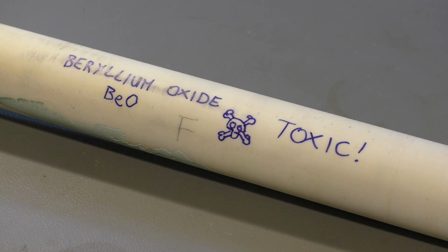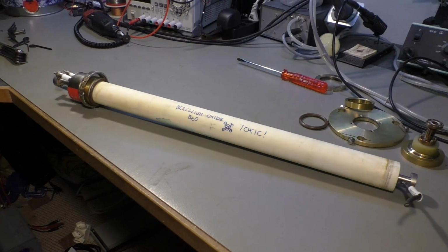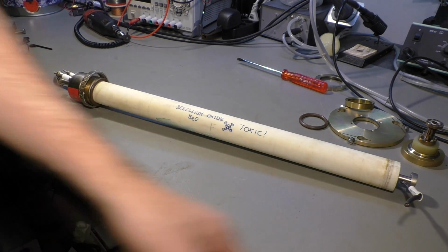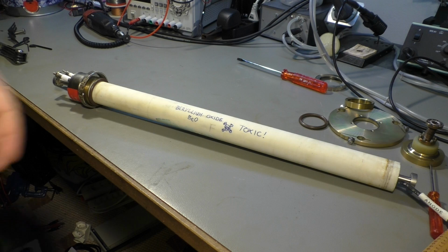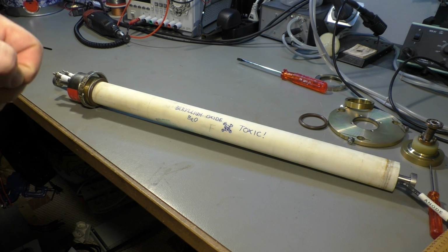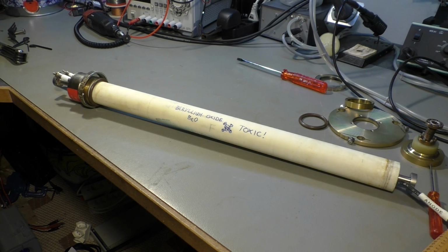Let me say a word about this white stuff here, this ceramic material the tube is made of. It's beryllium oxide, which is an absolutely wonderful material. It is light, it is very strong, it has good electrical insulation, and it conducts heat very well from inside to the outside. But if this material breaks, or if you start to grind it or want to drill it or smash it with a hammer, you shouldn't do that, because it creates dust. Of course, everything makes dust when you hit it into pieces, but this dust is extremely toxic. So if you breathe that stuff in, you will almost 100% sure get lung cancer. So it's better you leave it in one piece.